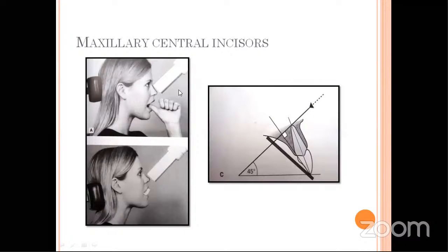So there the film holders were used, but here you need not have any film holders. Okay, so this is a picture which depicts the IOPA which is taken in a maxillary central incisor by means of the bisecting angle technique.